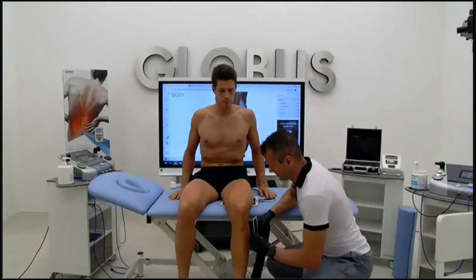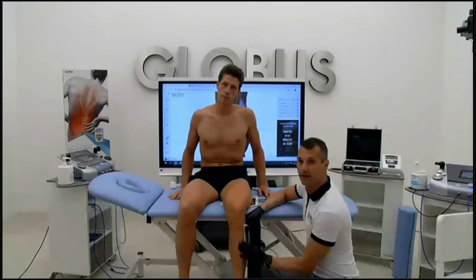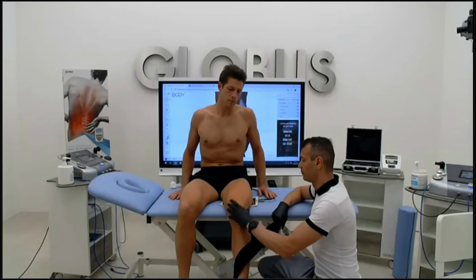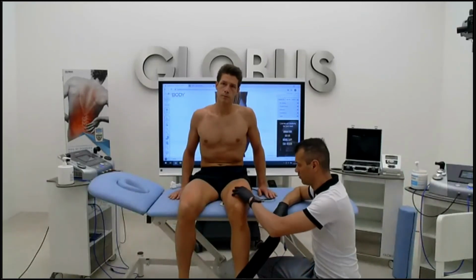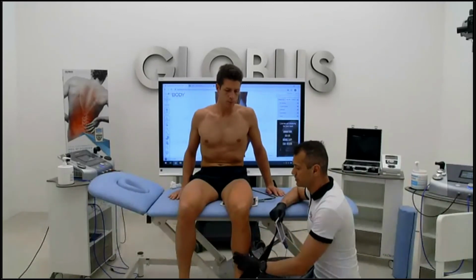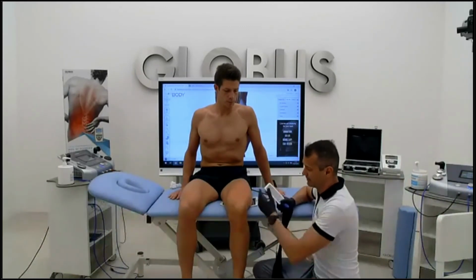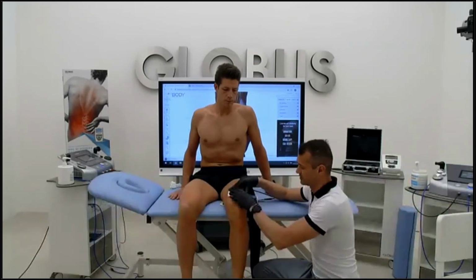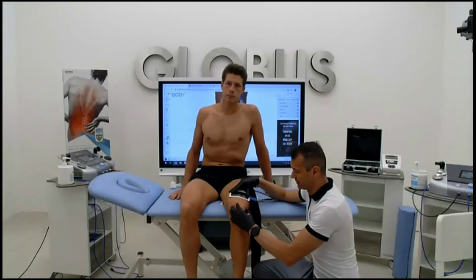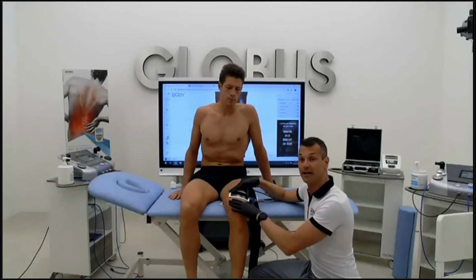Imagine that we can put a couple of plates, one here and one here, banded with an elastic band, and we can promote a warming of the whole knee. But if we want to do something more superficial, we can put just the small plates, one here and two down here, and we have the electromagnetic field just on the superficial layers.